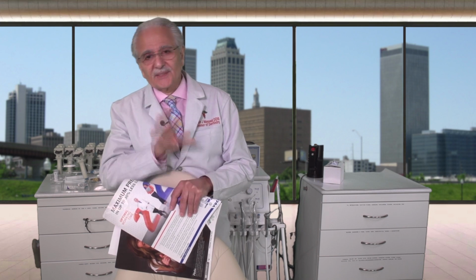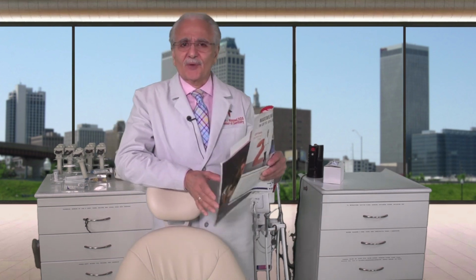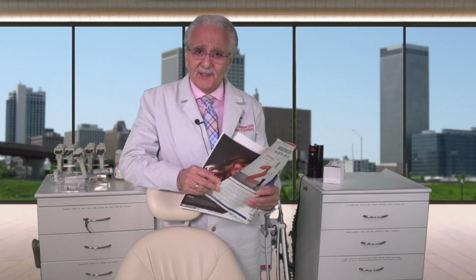And once we do that, then we have these numerical numbers, and there's a formula which you'll see in the article: how much space do you need for an overdenture with studs? How much do you need for a bar case? How much do you need for a fixed or a hybrid case? I think these are very, very important that we all understand, because we get caught having problems like this. It's tough.